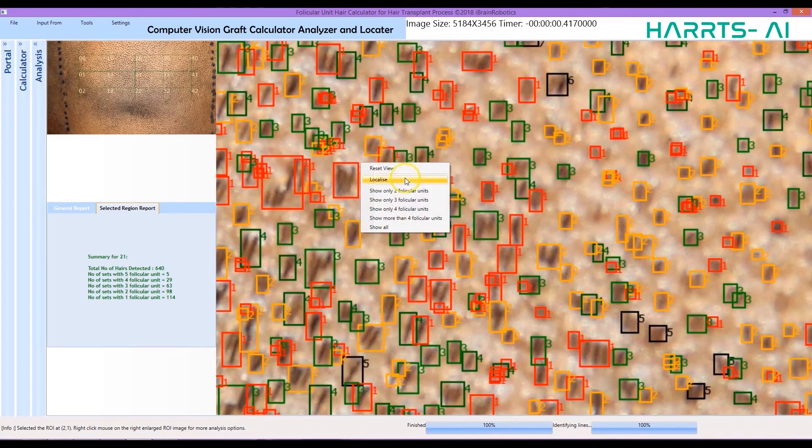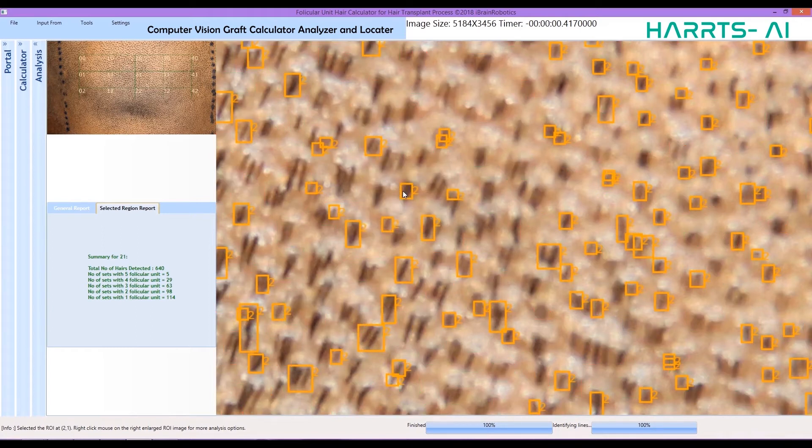You can also differentially locate 1, 2, 3, or 4 hair follicular units in the entire area of interest, or in each square unit area of the area of interest.